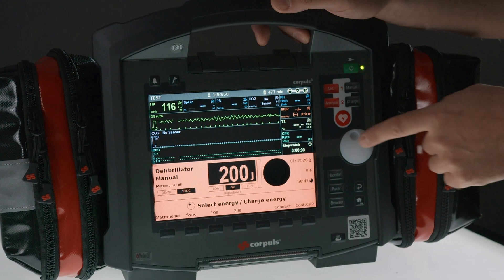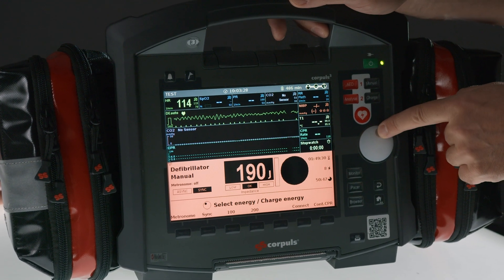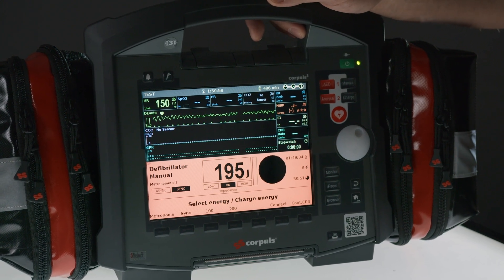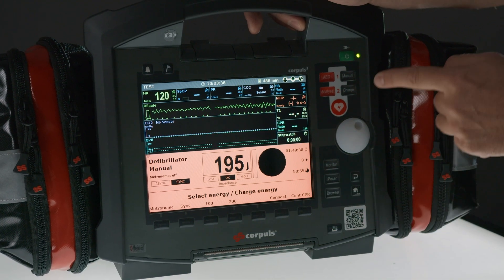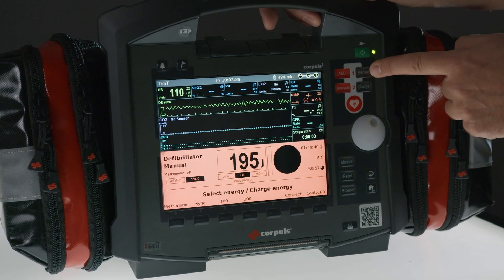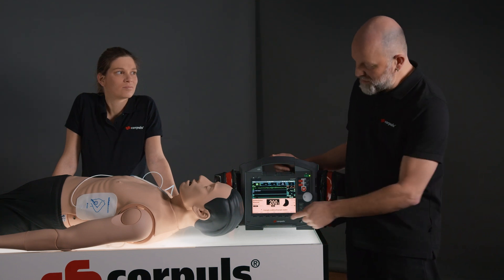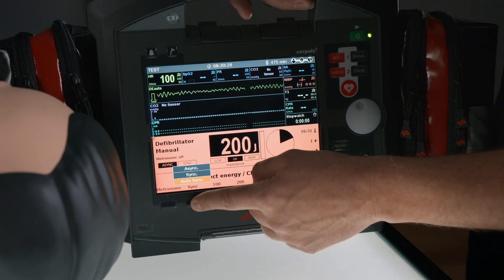The energy can be selected and confirmed using the jog dial. In addition, I can also select the energy using the soft keys 100 and 200, after which the energy can be charged. With the soft key Sync, you can choose from three different synchronization modes: Auto Sync, Sync, and Async.